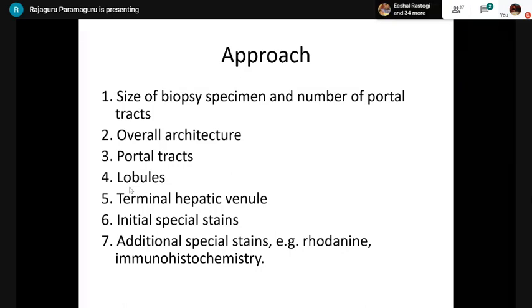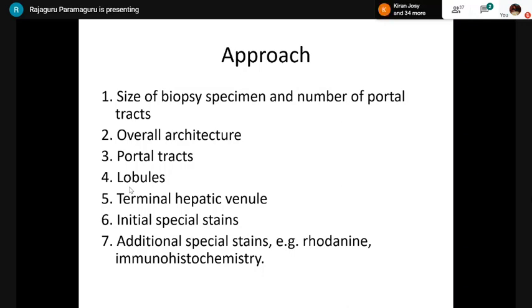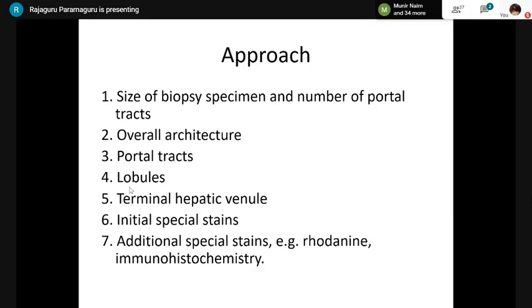How to approach a liver biopsy: first, confirm adequate size and adequate number of portal tracts. Then assess overall architecture on low power — the cord pattern, relation of hepatocytes to portal tracts and terminal hepatic venules. Then focus on the portal tracts — structures, inflammatory cells, fibrosis. Then examine the lobules — hepatocytes, sinusoids. Then the terminal hepatic venule for zone 3 pathology. Then use special stains to confirm your diagnosis, and immunohistochemistry if needed.